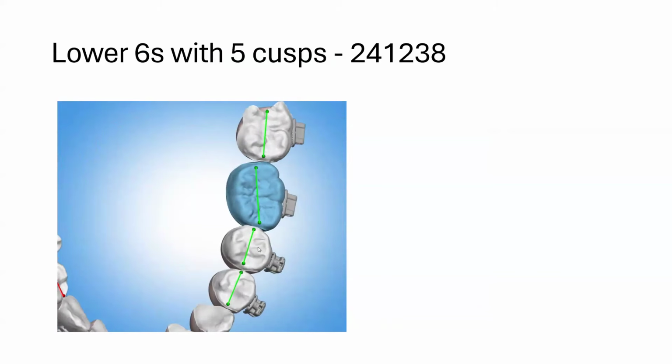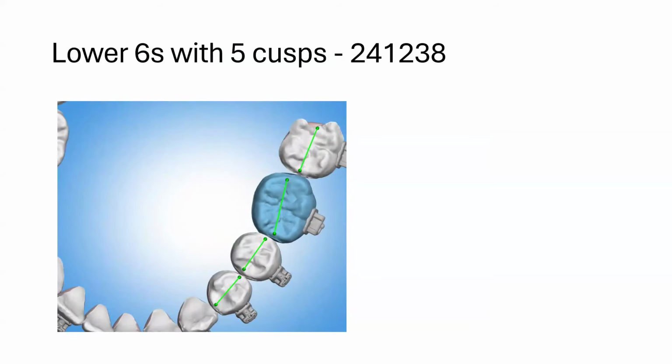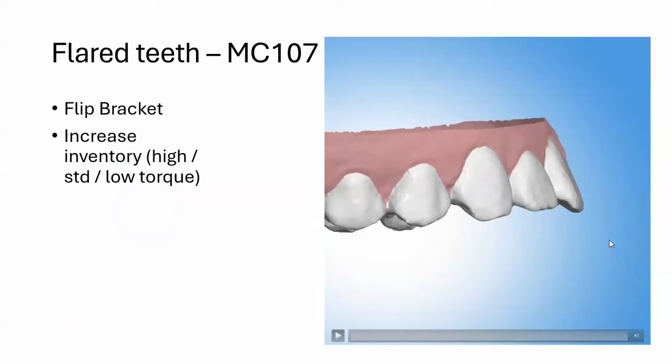But what really happens is that's a big molar with some big roots, it kicks your lower 7 out buccal. And you end up with lower 7s that are in crossbite. For years, I've been seeing these lower 7s that end up in crossbite, and none of it made sense to me. It does now. So you either have to take that bracket and cheat it to the distal significantly so that you don't rotate that molar, or you have to wedge the base. I would say on lower 6s, I have to do this sort of customization on at least 60% of the cases, so that we end up without crossbites of the posterior 7s and the type of flow we're looking for.